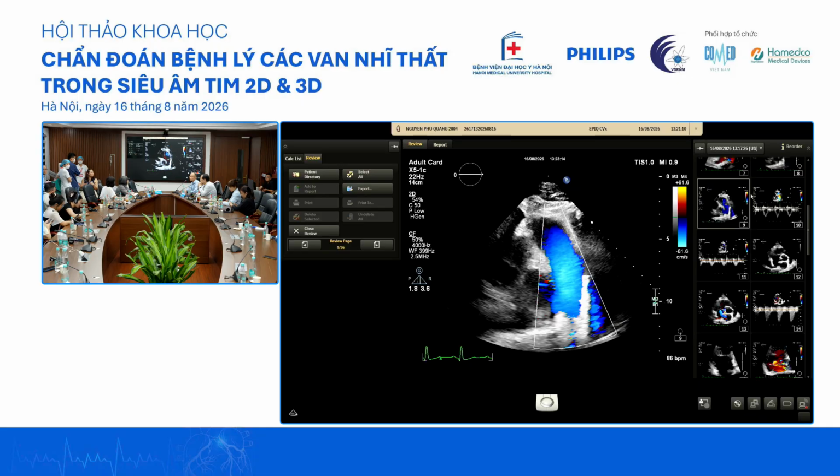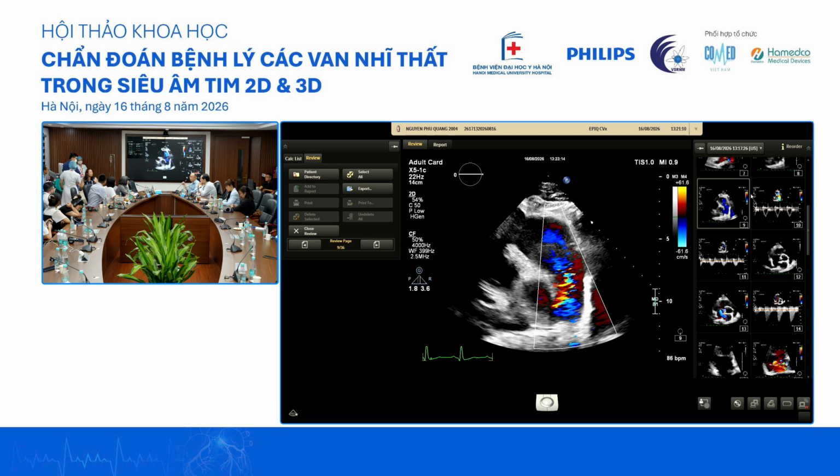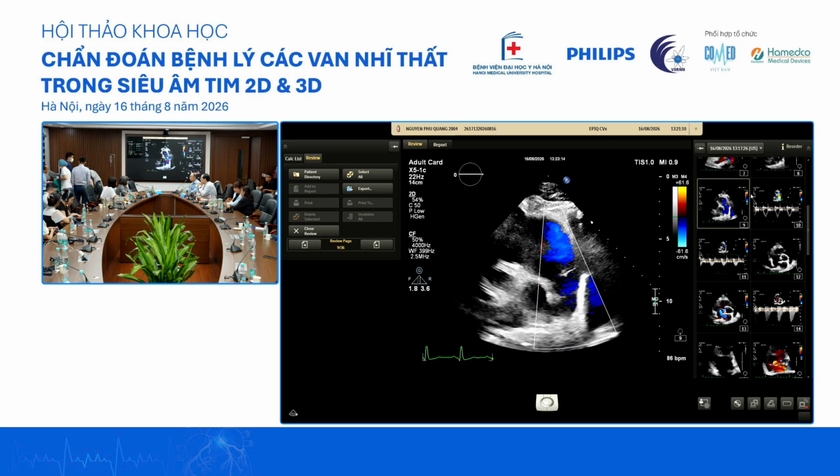Yeah, and then last but not least is to move on to MRI to look for changes. Just the dimension alone, you have one major criterion for ARVC, but we still need the structural findings, such as a small aneurysm, which I don't see because it's very echogenic. I don't see apical traction on the RV, which suggests an increase in eccentricity on the RV side. But MRI can also help with the quantitation of the TR. But I think TR is just the egg. I think the chicken is in the RV.